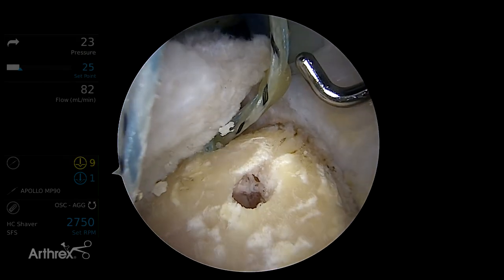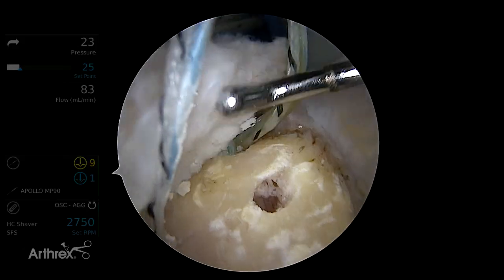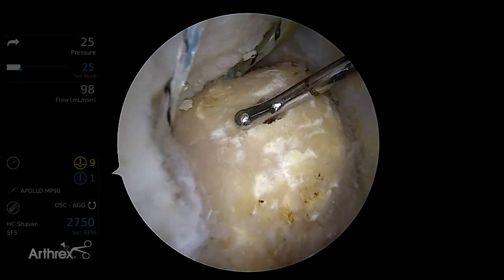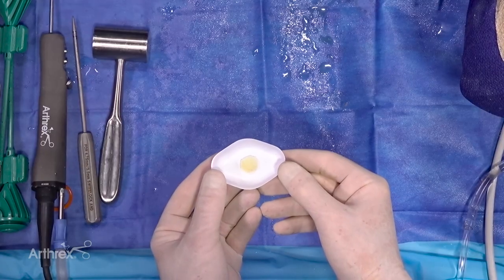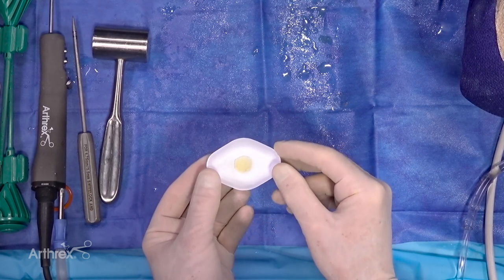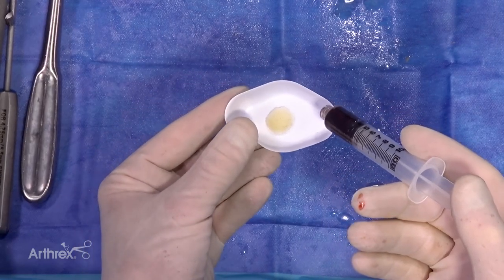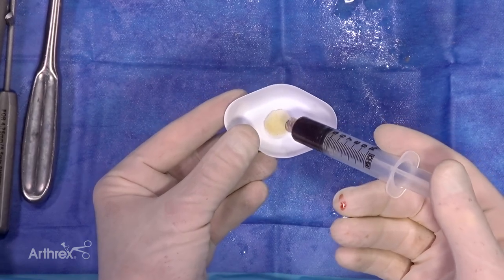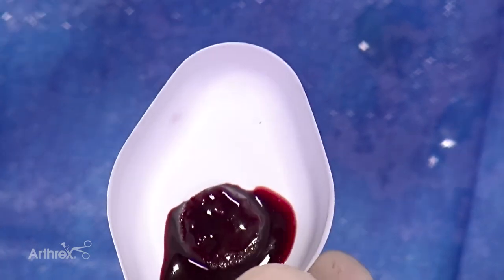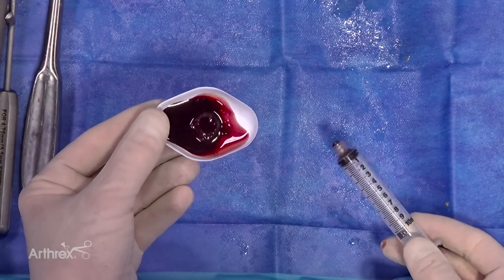We're going to apply the bio button to our knotless mechanism so the bio button will lay at the footprint, and then we'll complete the double row repair over the top of the bio button to compress it to the tuberosity footprint. Here's our bio button — this is demineralized cancellous bone matrix; this specimen is three millimeters thick and twelve millimeters round. Here's the application of our BMC to the sponge — we're just going to let it all soak in. The recommended soaking time is five minutes for the button in the BMC.